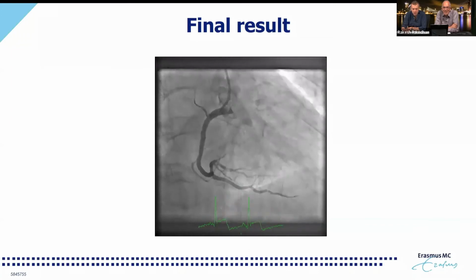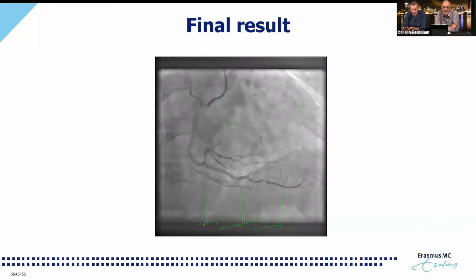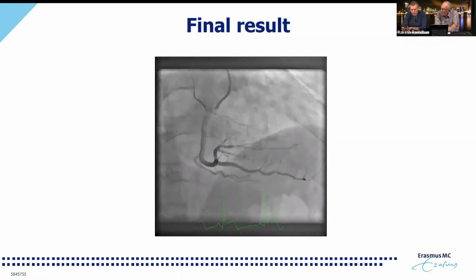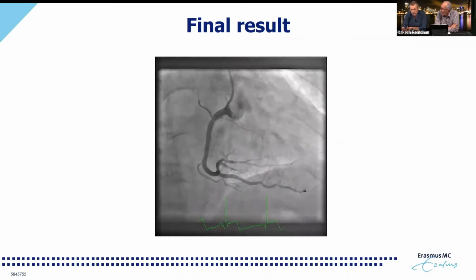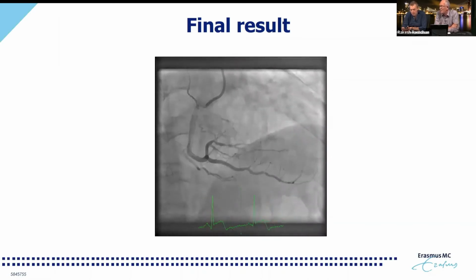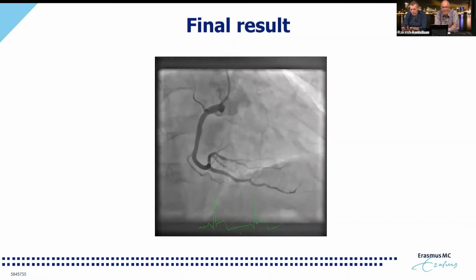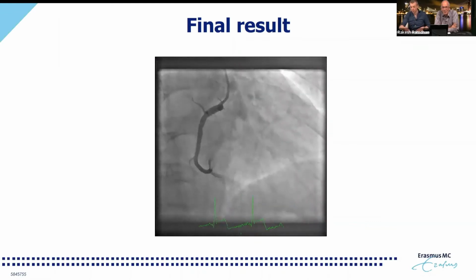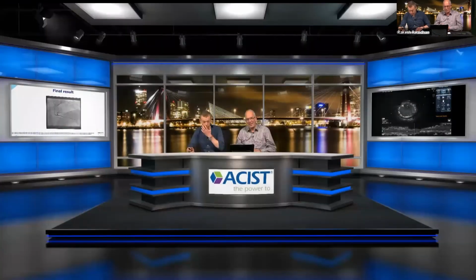the distal part, right, Jürgen? That was what you were referring to. You see the RDP coming up nicely, but then the posterolateral branch stops at 3 o'clock on the screen. In the angiogram pre-procedure. No, that's correct. So probably this is where the thrombus dislodged, and after some Integrilin and nitrates, the case was concluded with a TIMI 3 flow, but the blush was suboptimal. So far, case number 2.